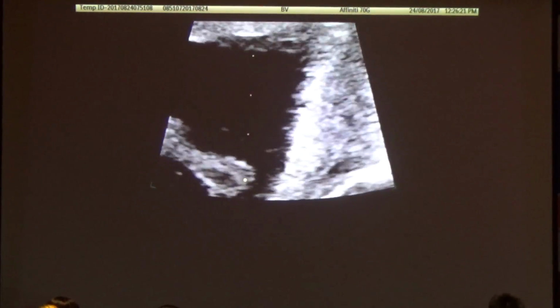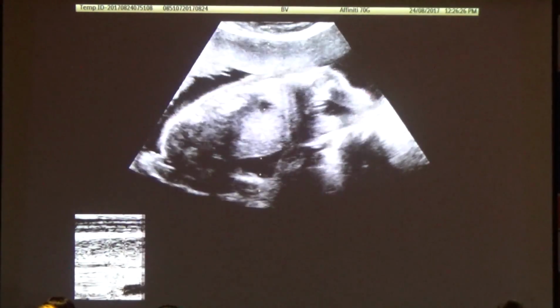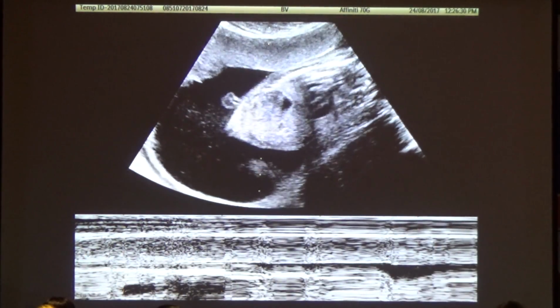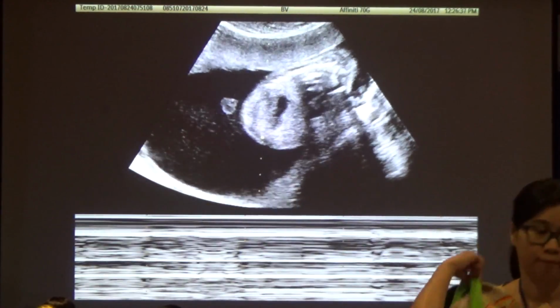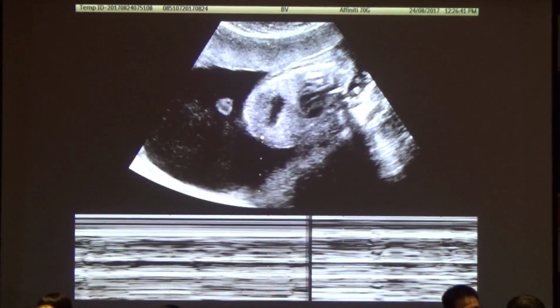Okay, where are we now? Now we want to come off soon. Okay, let's see where we are now. Okay. There's the ascending aorta and arch. Now I've got it. So there's the mitral valve.